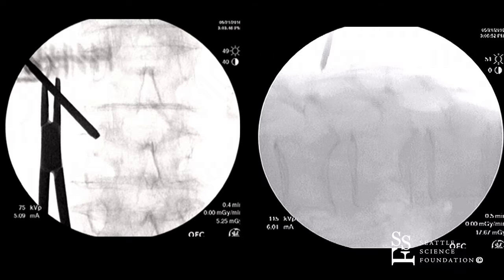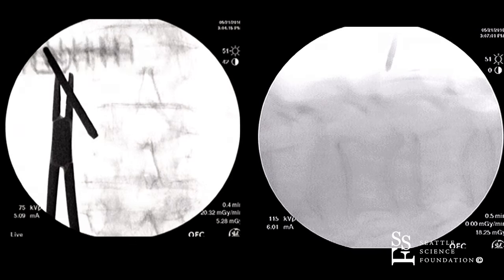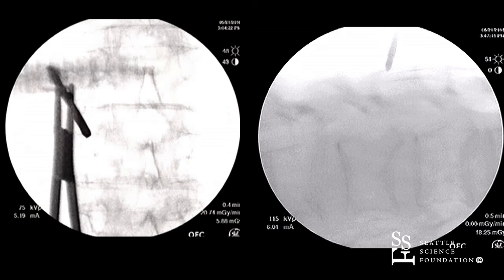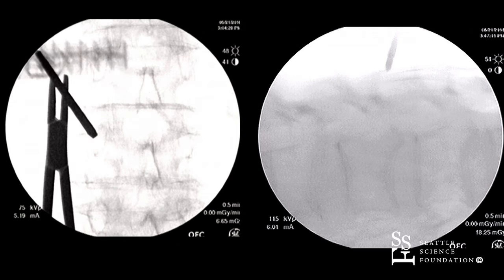We're going to have a good trajectory for the needle. Hammer, please. A lot of times we're using the hammer in patients who are quite osteoporotic. You have to be quite careful, making sure you're not hammering too aggressively — you can imagine what can happen if you do.